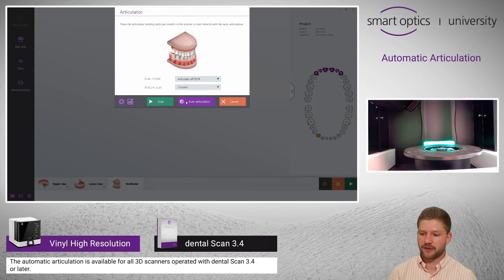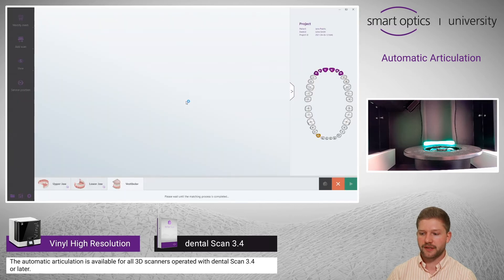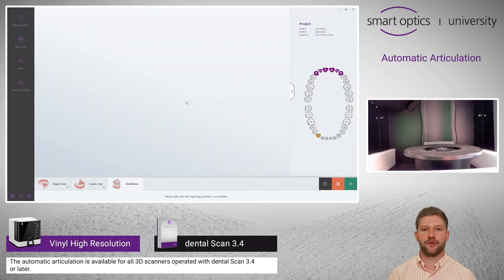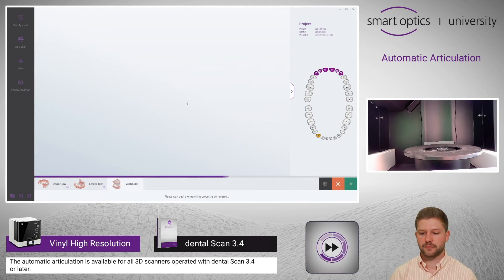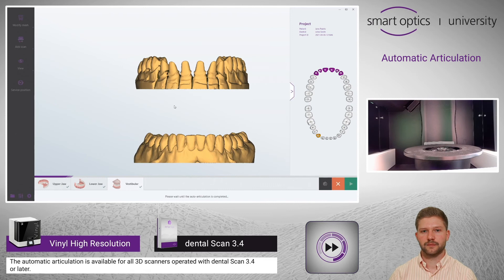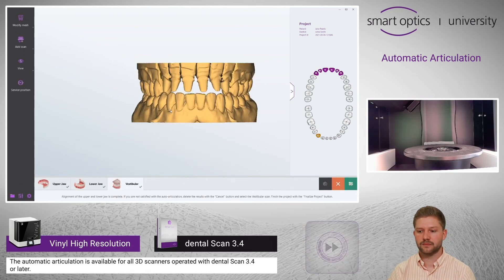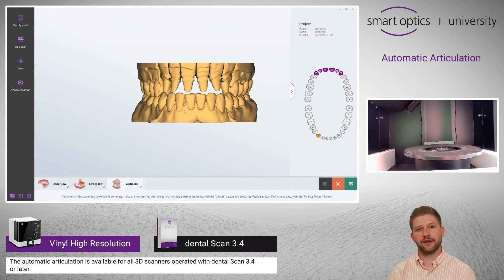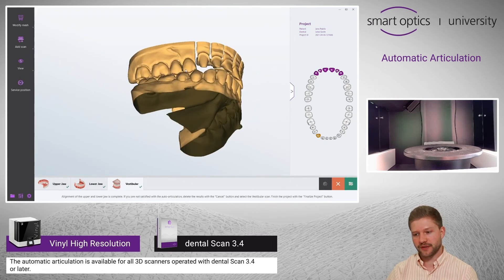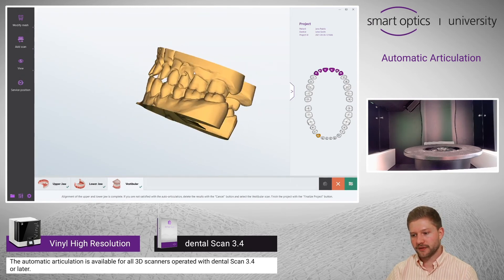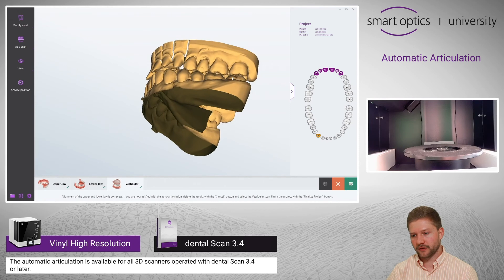I just press the button right here and I don't have to perform an additional scan for the vestibular. The calculation is finished. Now you have to validate the result, and this is looking very good.